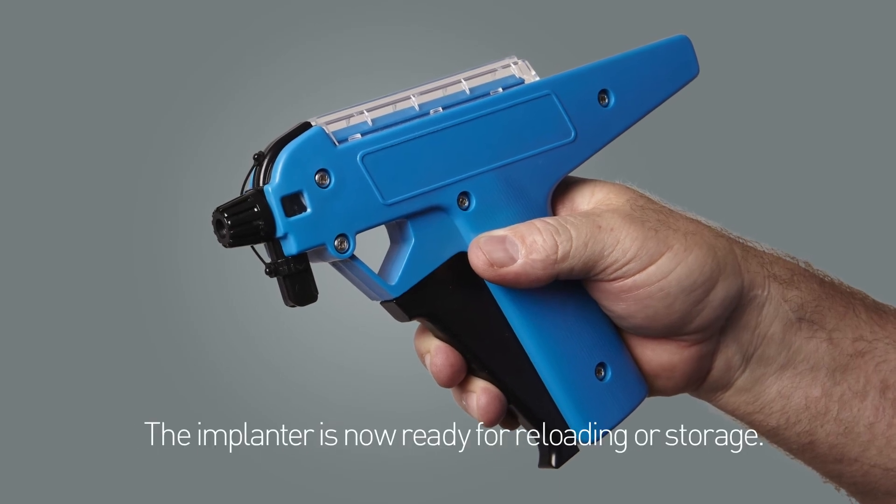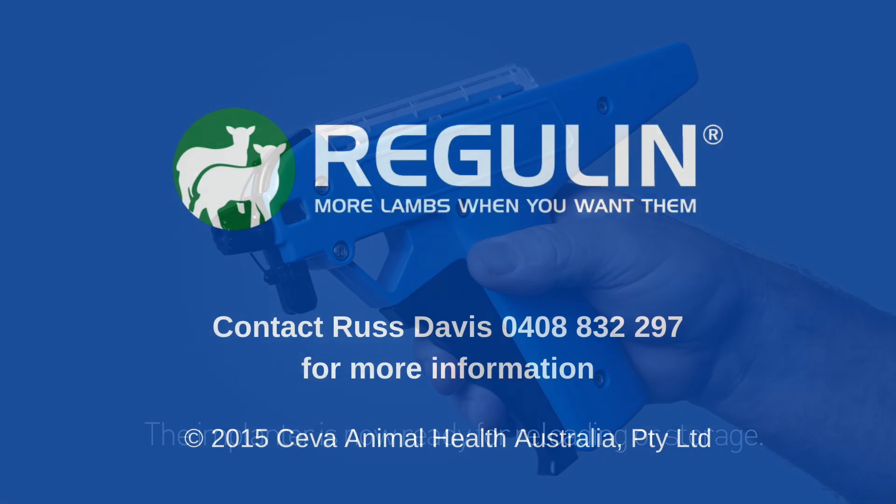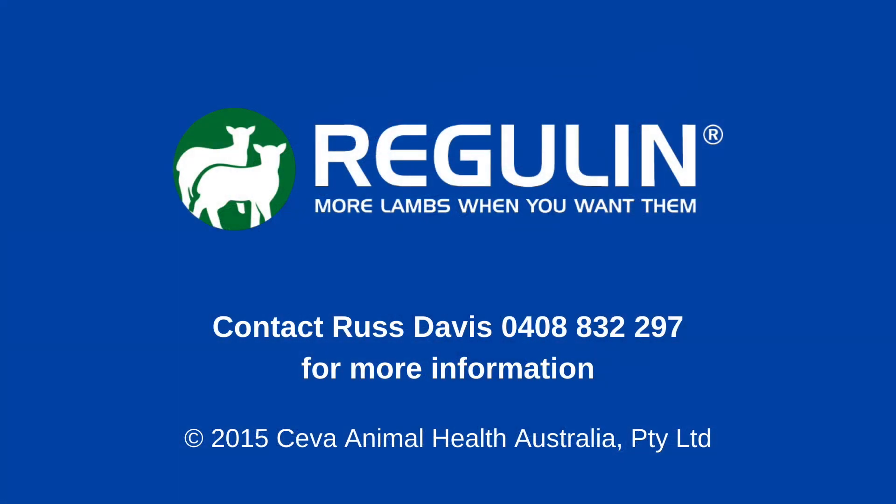The implanter is now ready for reloading or storage.